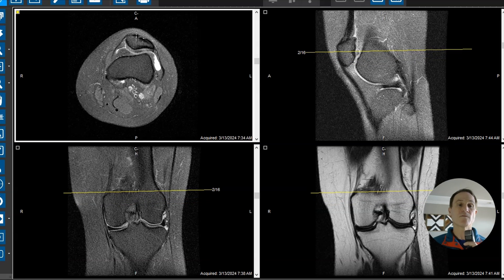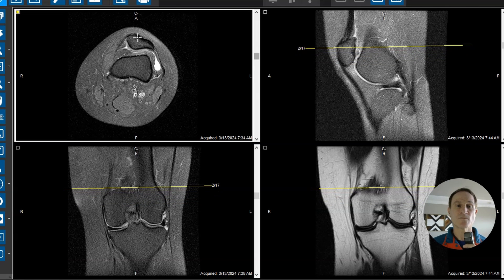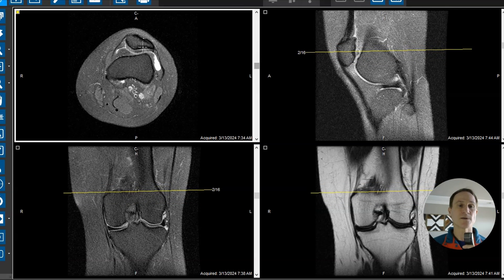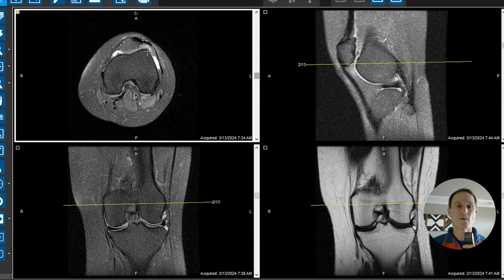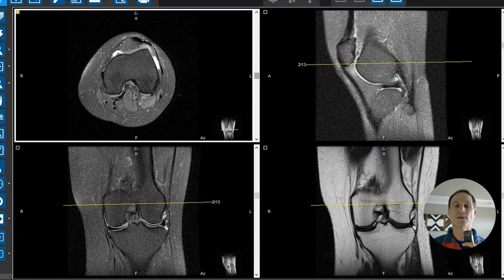So far we have mild lateral patellar subluxation, we have some borderline lateral patellar tilt, we have fatty impingement here, and these all go along with a patellar tracking disorder and pain in the anterior knee.